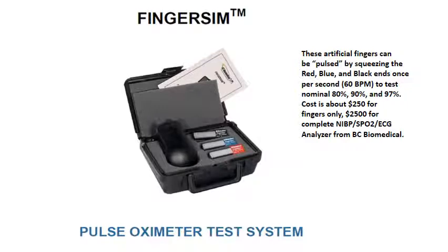These are FingerSim modules from BC Biomedical Group, and they're designed to simulate artificial human fingers. For 22.5 degrees centigrade, their nominal values are 97%, 90%, and 80%. However, for the more typical temperatures found in Tanzanian labs of, say, 35 degrees centigrade, those have to be derated to levels of 99%, 93%, and 83.5%. So again, they are temperature dependent because of the chemical or fluid that is used inside to simulate.